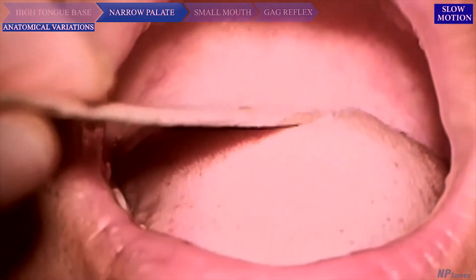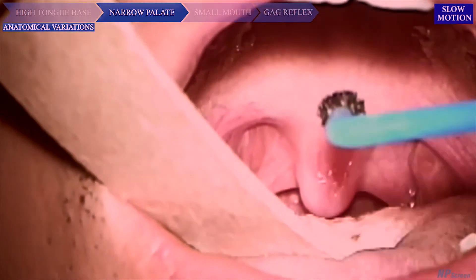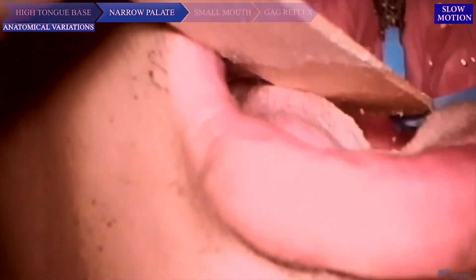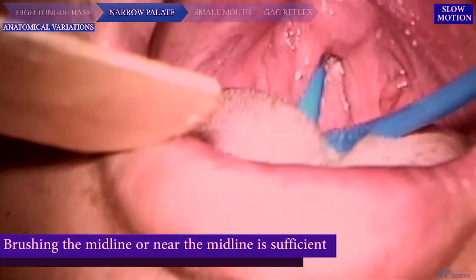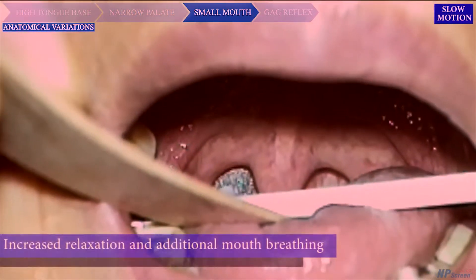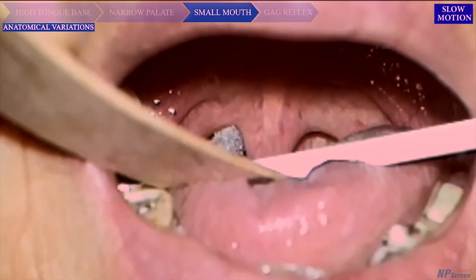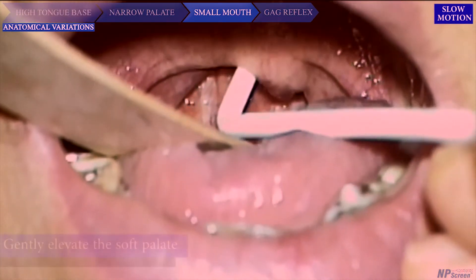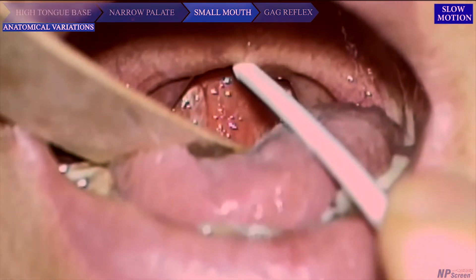Narrow palate: When the patient has a very narrow palatal arch and high tongue base such that visualization of the oropharynx is not optimum, the patient may become so tense that both sides of the nasopharyngeal wall squeeze into the midline. However, brushing the midline or near the midline is usually sufficient for sample collection. Small mouth: Increased relaxation and additional mouth breathing will usually increase exposure of the oral cavity. If the patient's mouth is small, using the brush to gently elevate the soft palate during insertion will allow access to the upper part of the nasopharynx.